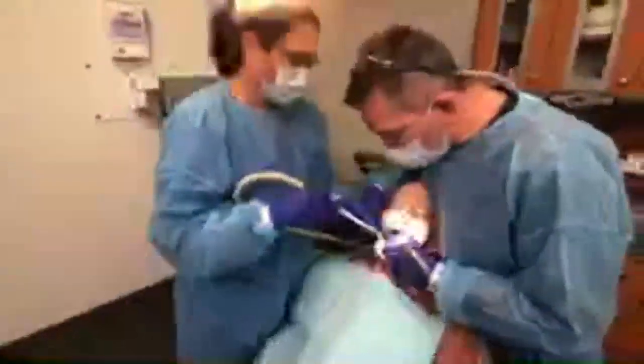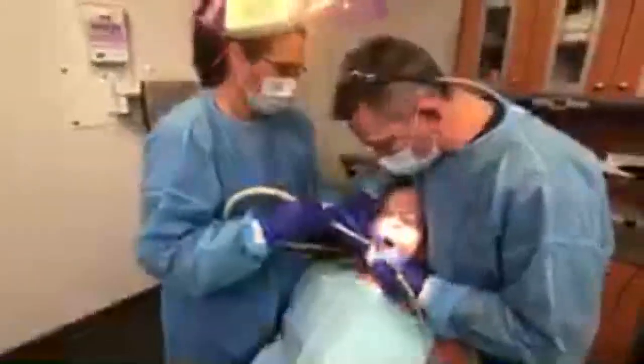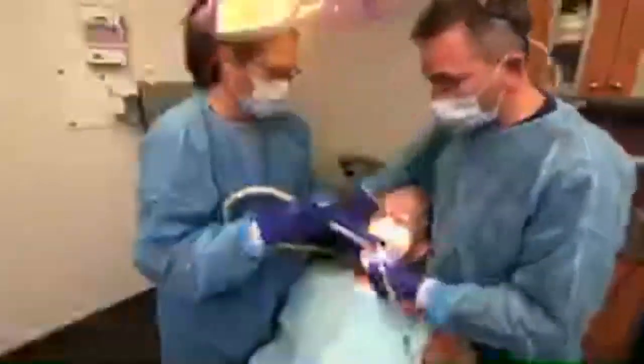Zeke, you okay buddy? Am I hurting at all? Good, awesome. So we're pretty much at the point of implant placement. I'm going to change the modification on my drill, put my special piece on, and choose the correct implant. In this particular instance I'm going to use an implant which in my eyes is one of the top implants available — it has the best surface, and of course there's a connection that goes on for the crown.